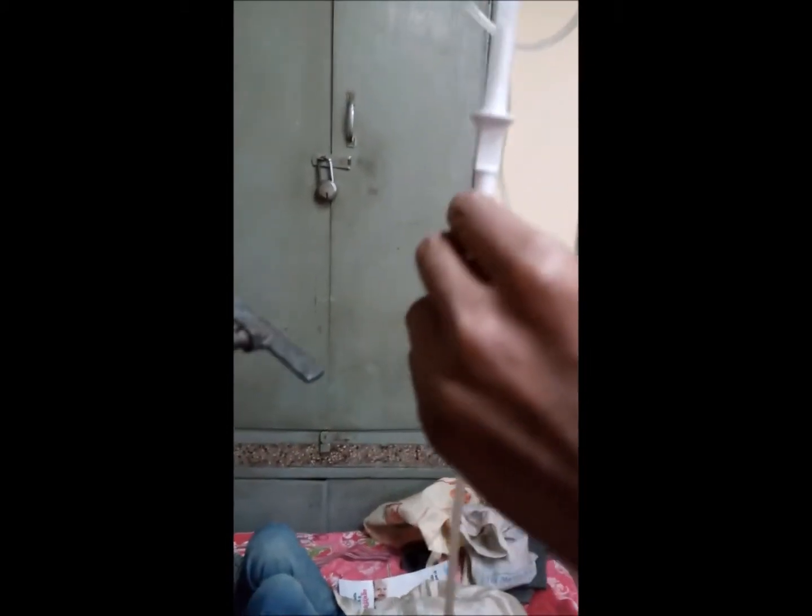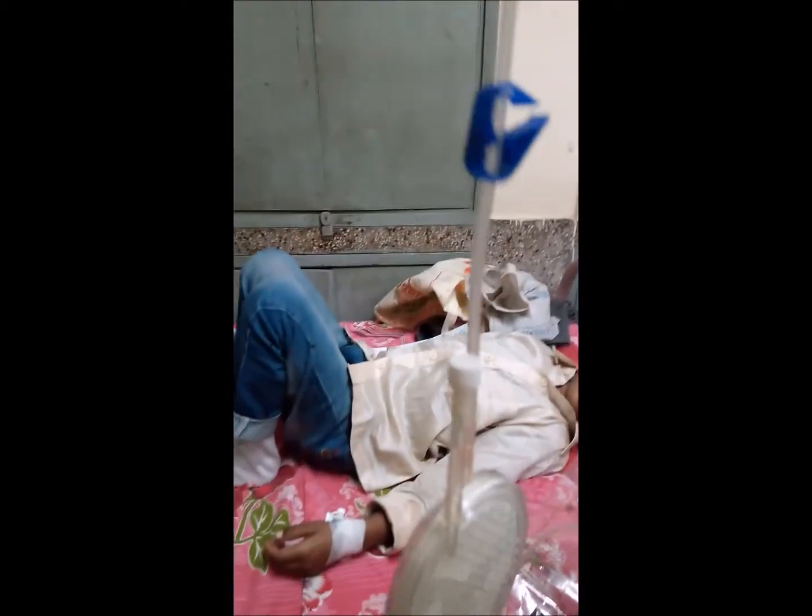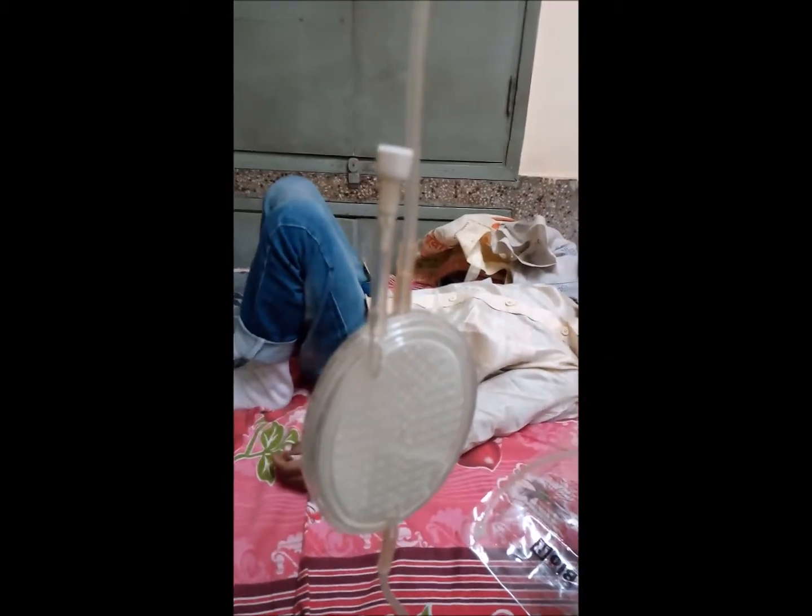The staff is now showing the components of the filter, which consists of a bag spike, the filter itself, the drip chamber, the roller clamp, and the needle end. After insertion of the bag spike into the blood bag, the staff is now inserting the bag spike into the blood bag.